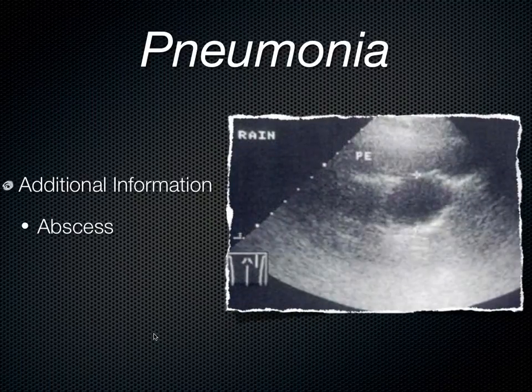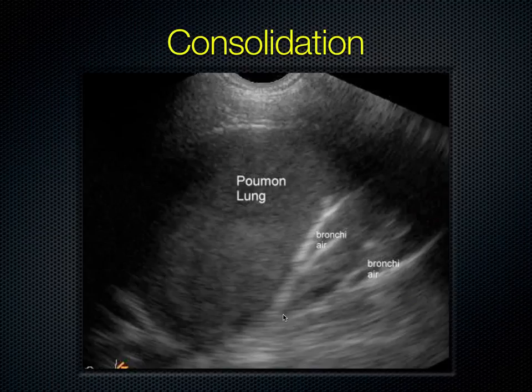Ultrasound has also been used to identify abscess. Within the lung, it's usually very circumscribed and discrete, sometimes with some fibrin or exudate in the dependent area. Here's a great example that one of our French-Canadian colleagues offered, of the air bronchogram, the bronchial tree visible within the lung.